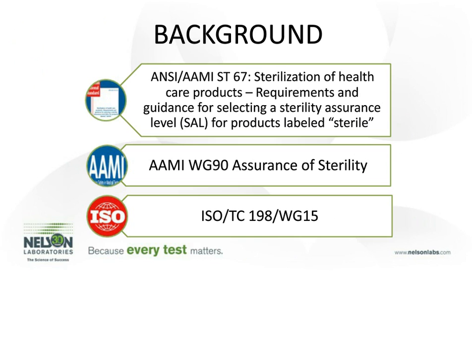So a little background on why we believe this webinar is of importance right now. Currently, we have a document in the U.S., and that's that first bullet point there. It's AAMI ST67, and it talks about the sterilization of healthcare products and the requirements and guidance for selecting a sterility assurance level for products that are labeled sterile.